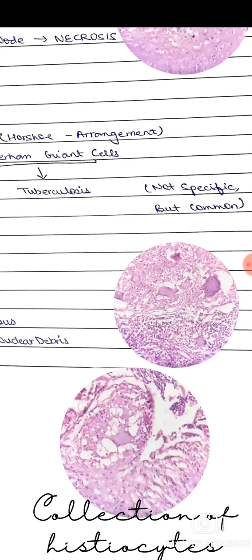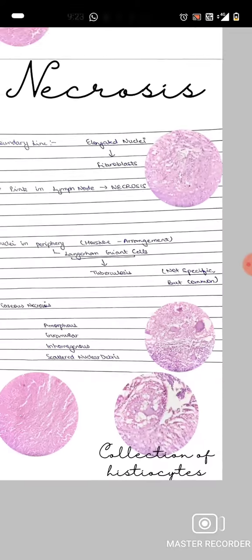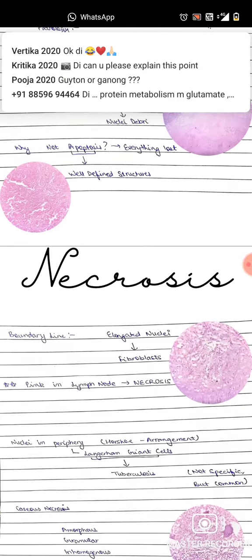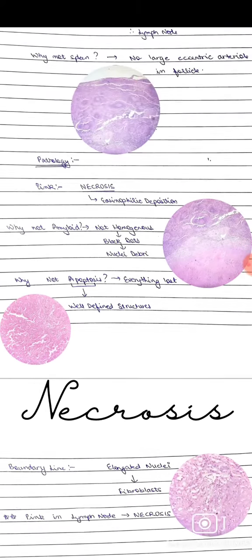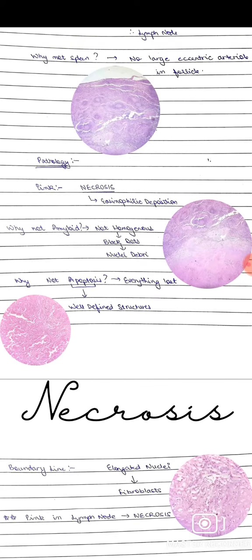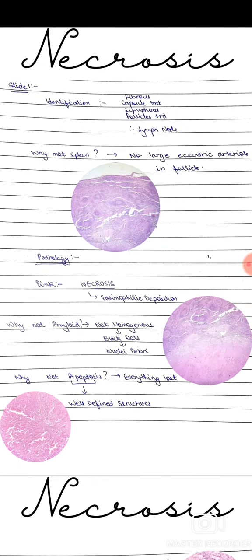Finally, we can also see collections of histiocytes. This was all about the histopathological slide of necrosis in a lymph node. Thank you.